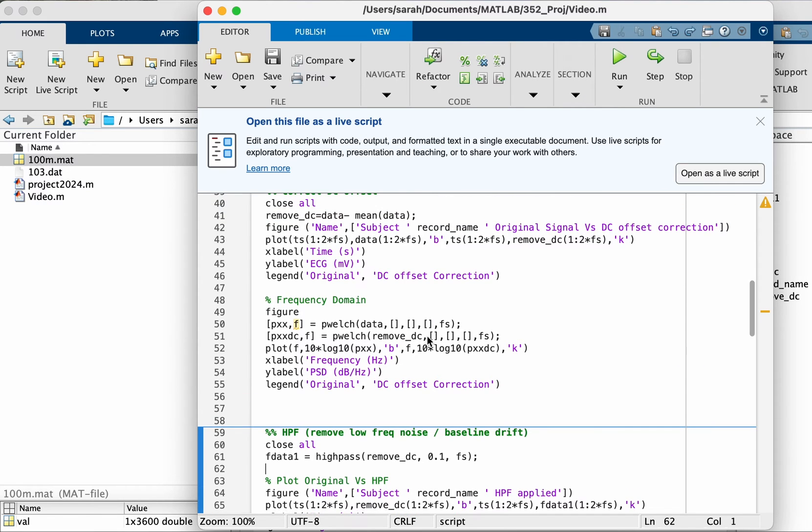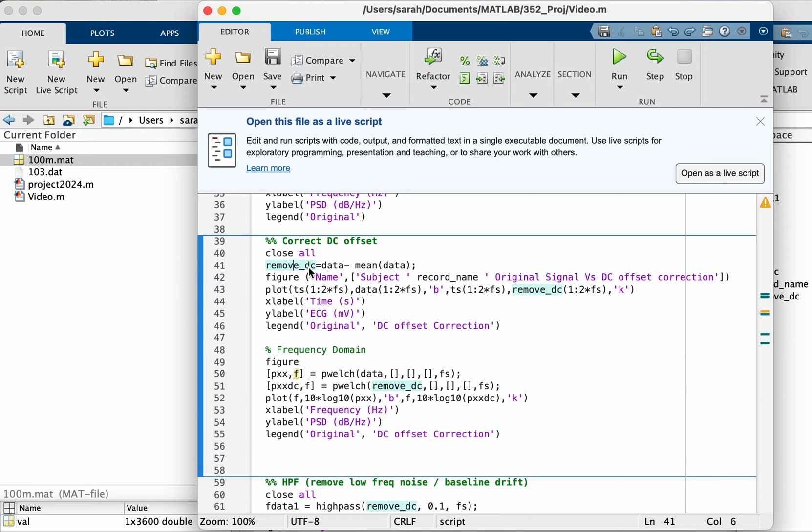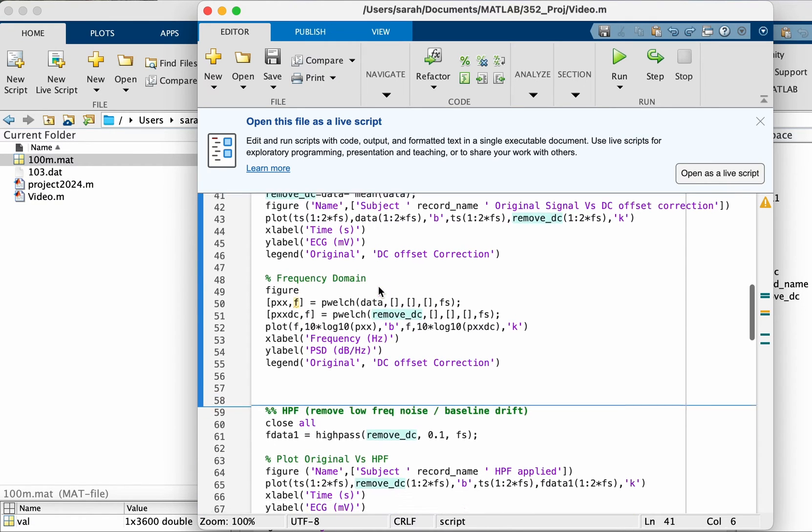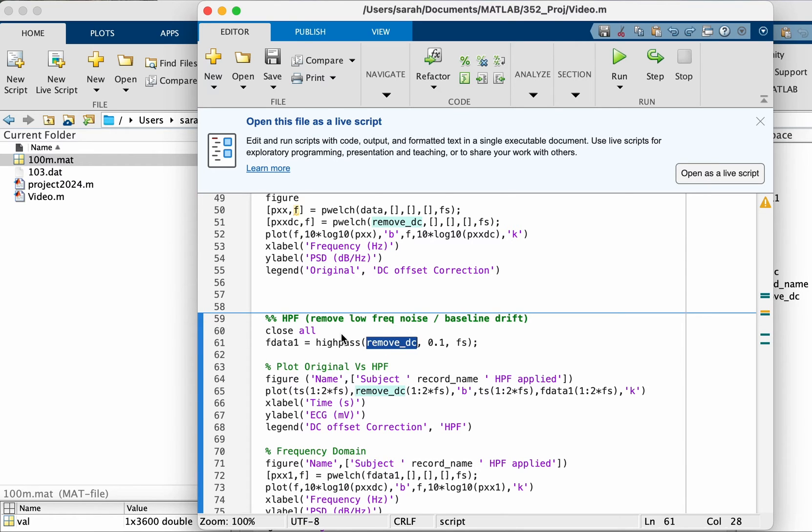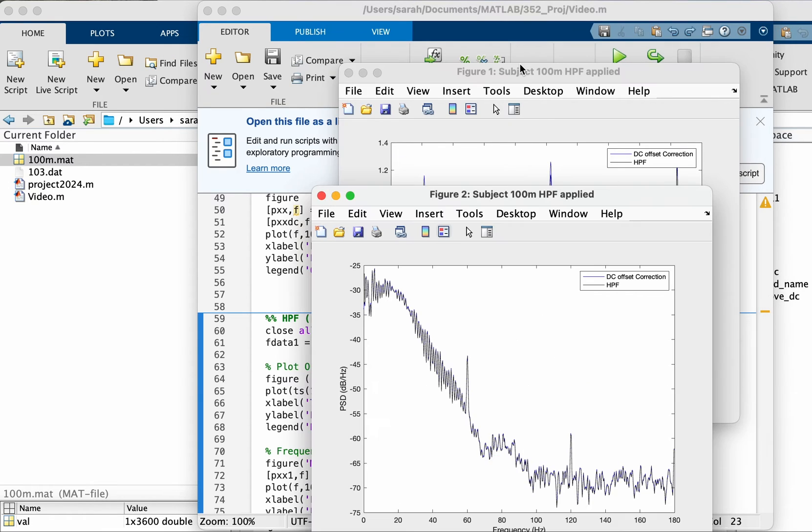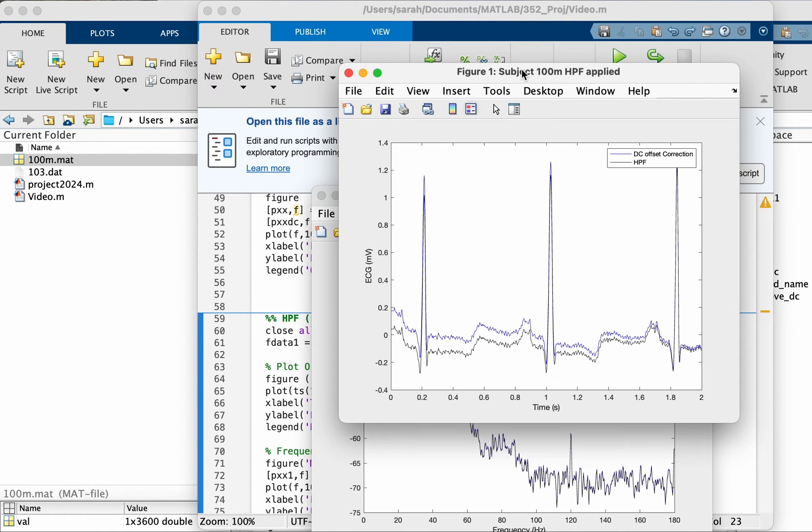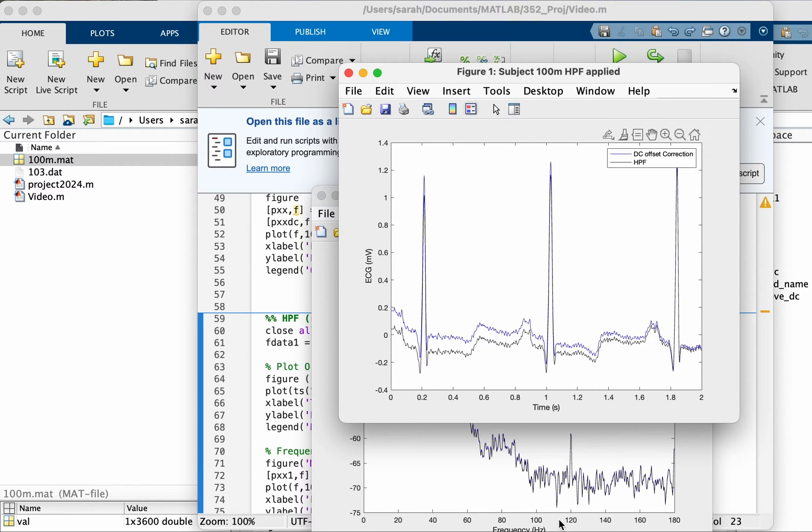Now taking the result of the previous step, which is this signal after removing DC offset, I'm going to take this signal and apply the high pass filter on it. Let's look at after applying the high pass filter what happened to the signal in the time domain.